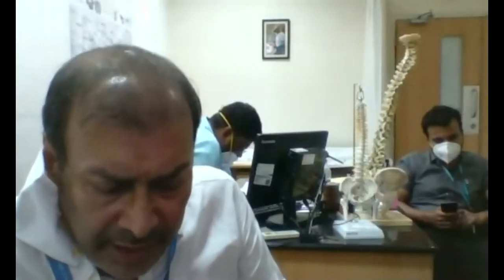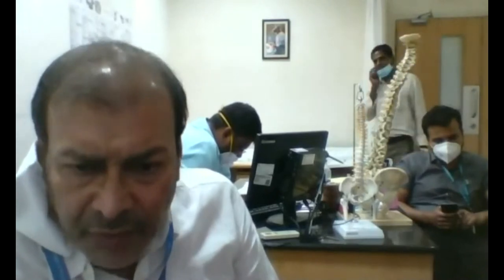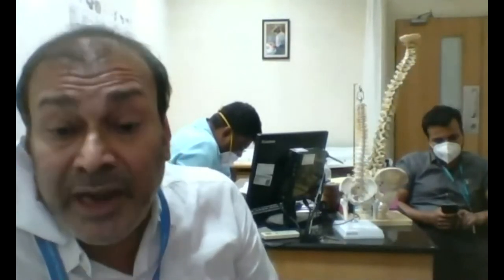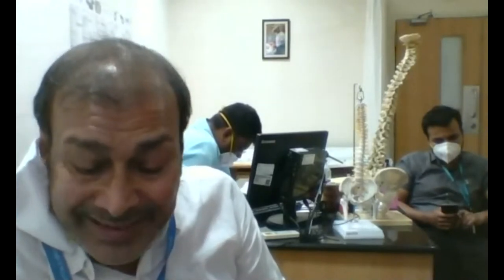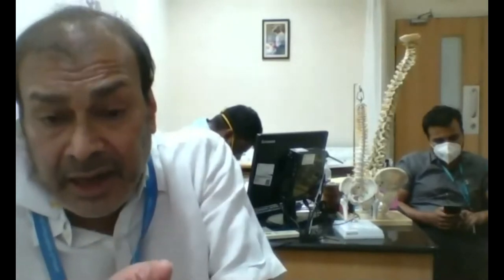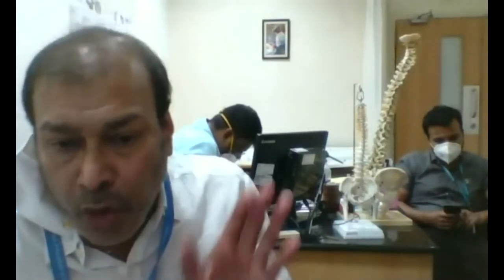If you're doing a myelopathy case from the front with an indirect decompression, you're actually avoiding going right down, and you invariably have issues like dural injury and dural tears, which in the cervical spine you find very difficult to suture or to close. So with this indirect form of decompression, which I think Ajoy showed, you burr out a little bit of the two vertebrae, which you then raise up and indirectly create the space in the spinal canal, so that you're not going inside at all. You're just creating an indirect decompression. So that way you avoid that.